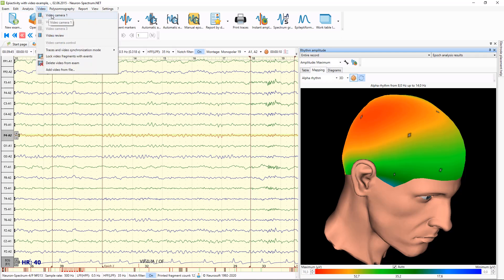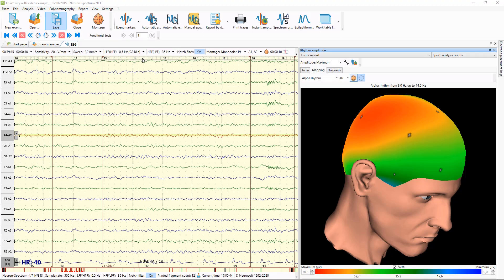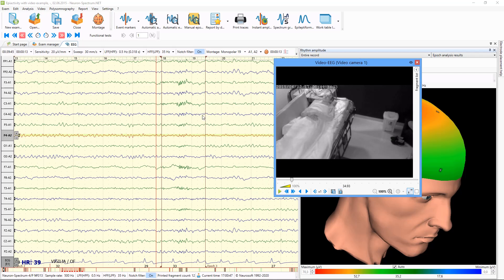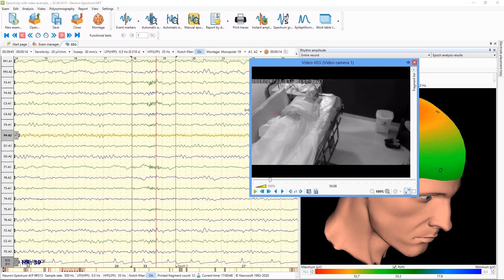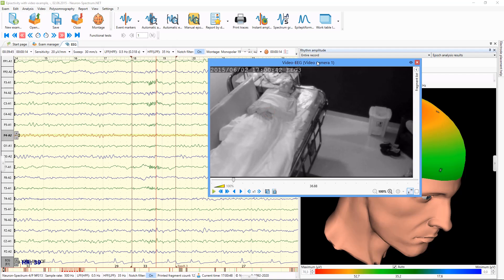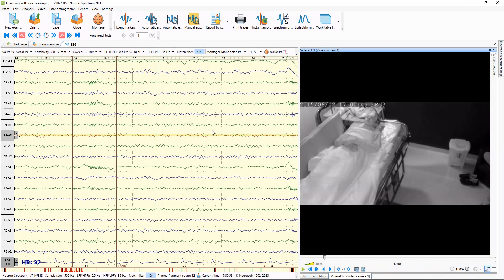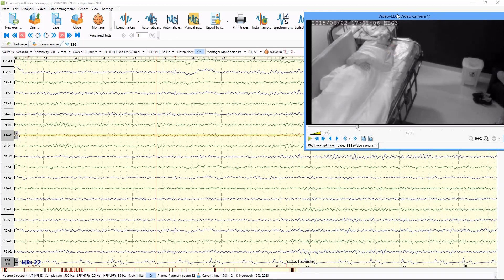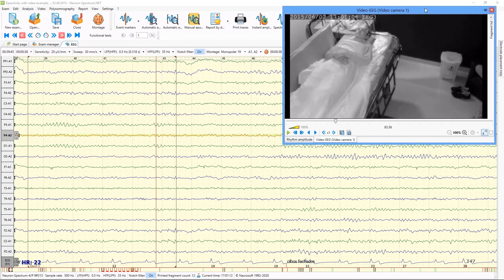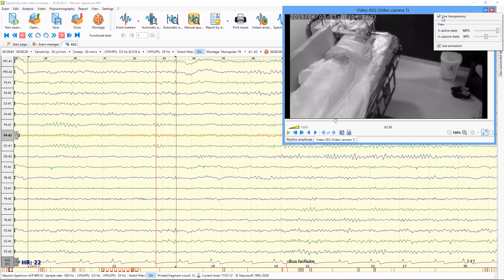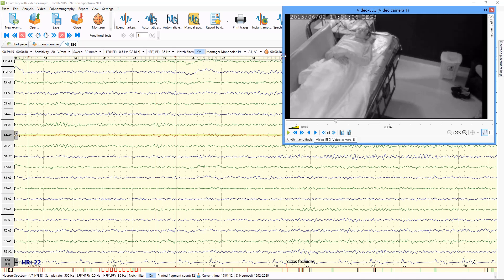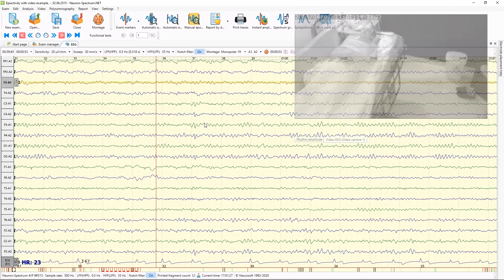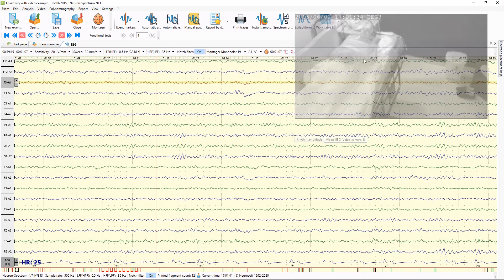In the Video main menu, you can open all video cameras which were recorded during the examination. In this examination we have only one camera. You can locate the video window on screen, or you can make it semi-transparent if you use the transparency option. So you can review traces and review video simultaneously.